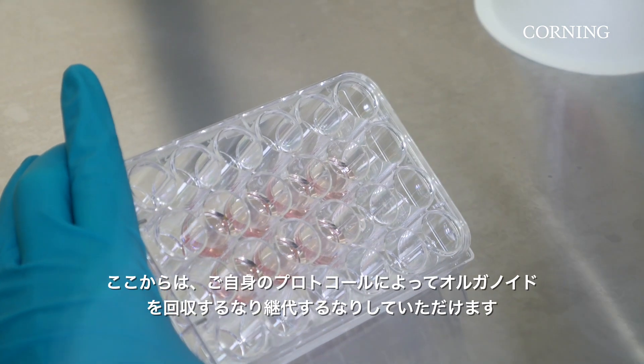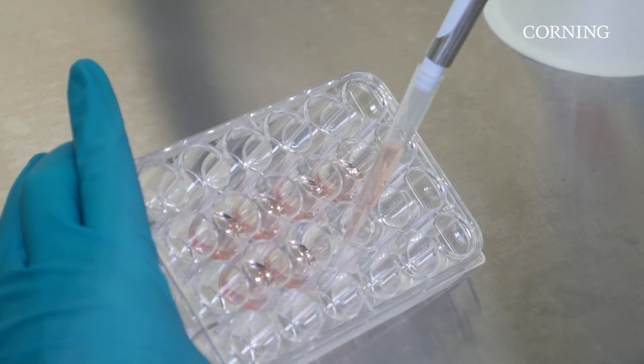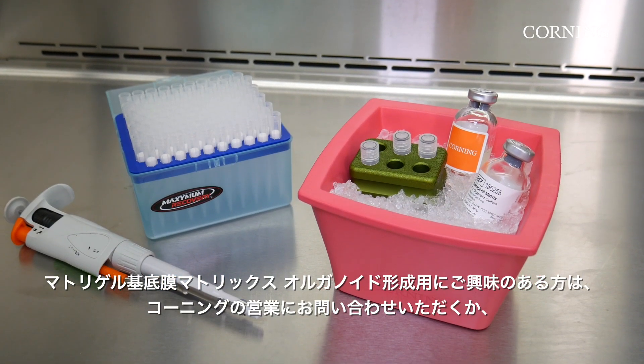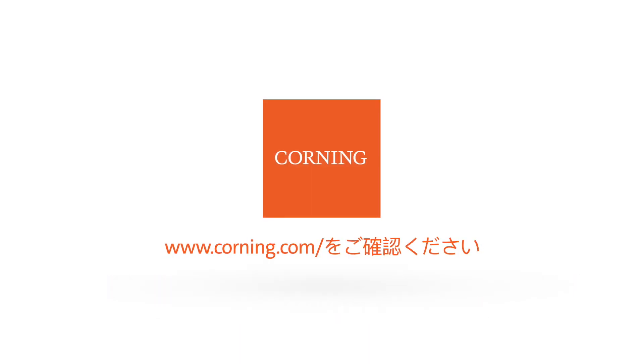You are now ready to extract your organoids or further passage according to your protocol. To learn more about Matrigel Matrix for organoid culture, contact your local Corning account manager or visit corning.com/matrigel-for-organoids for more information.